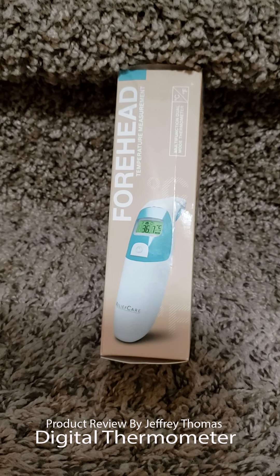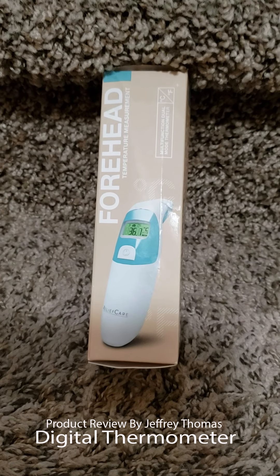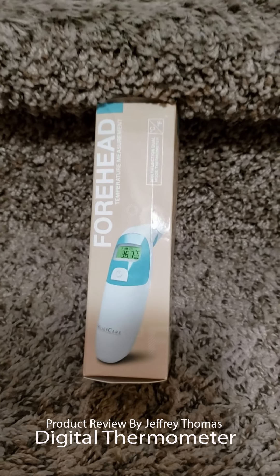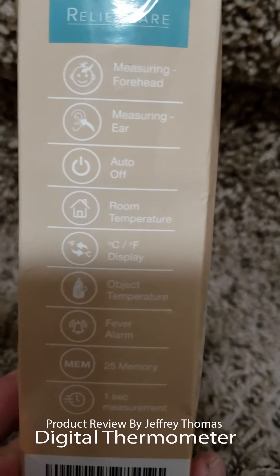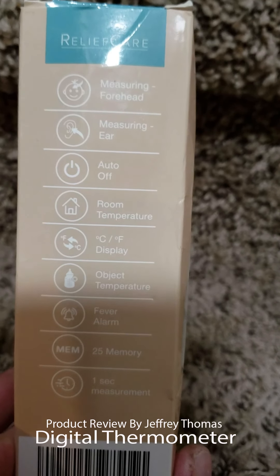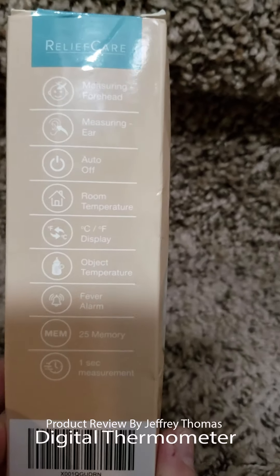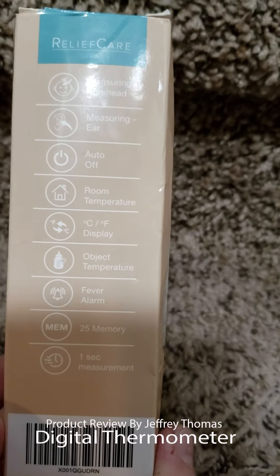Today I have for you a digital thermometer that runs on batteries. It does the forehead or the ear. It measures both, and it has an auto-off feature, room temperature display, and both Celsius and Fahrenheit modes.